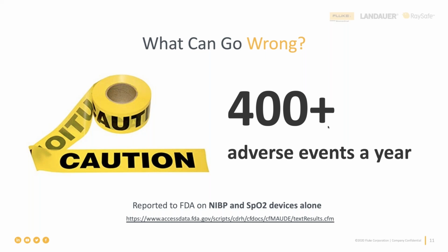But what's important to notice here is that this is just one country. Now, think about the scale at which all this may happen on the global scale as well. And those are really huge numbers if you think about it, because this means that just in the US, over 400 monitor parameter failures get reported while those monitors are connected to the patient.